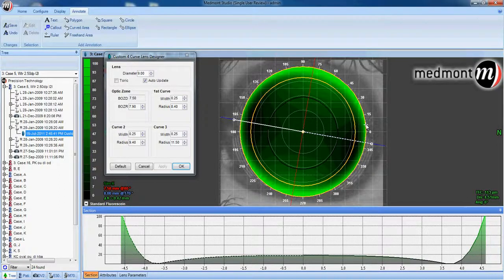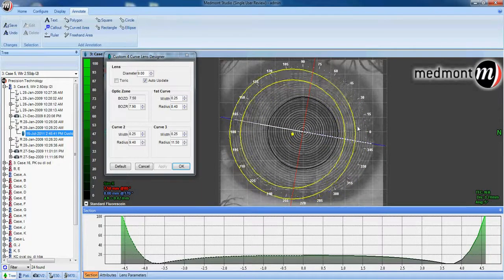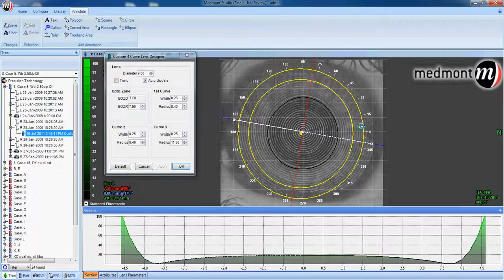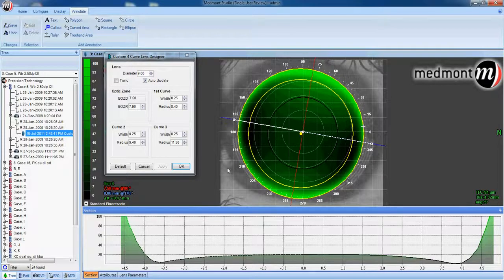Next, let's pick up the contact lens and place it somewhere near the geometric center. So ignore the placido and center the contact lens in relationship with the sclera. So looking at the white of the eye around here and placing your contact lens as it appears centered not to the placido rings that you can see just outside of the lens, but more so to the iris or limbus.